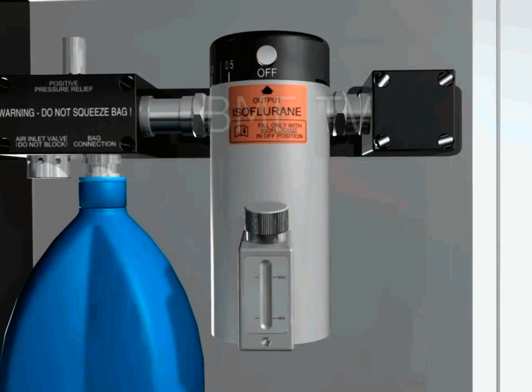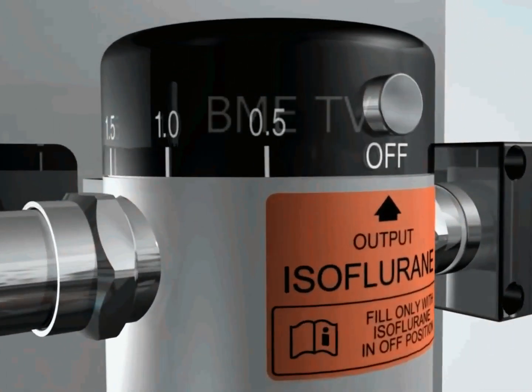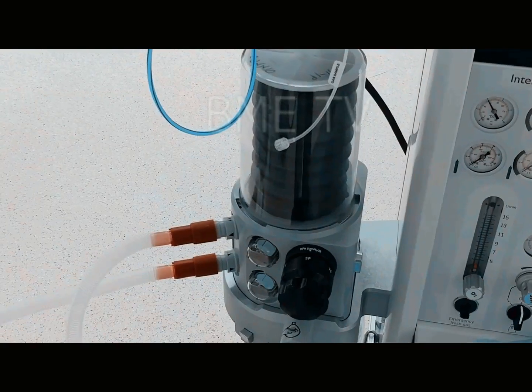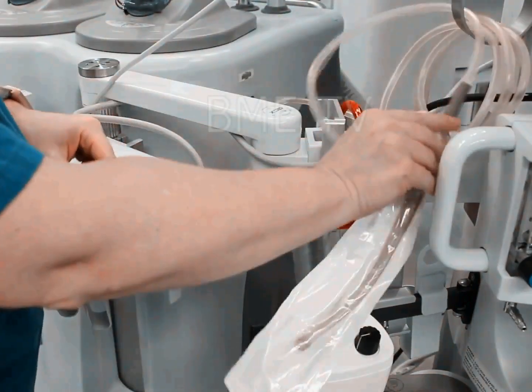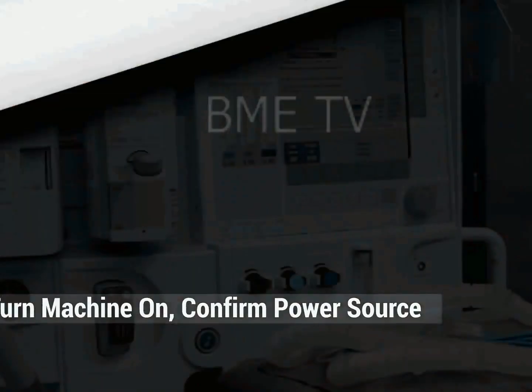Anesthetic machines are distinct from anesthesia carts, which hold various adjuncts for anesthesia such as intravenous medications, syringes, needles, and other items of equipment that the healthcare worker providing anesthesia might need. In dentistry, a simplified version of the anesthetic machine without a ventilator or anesthetic vaporizer is referred to as a relative analgesia machine. Let's look into types of anesthesia machines.